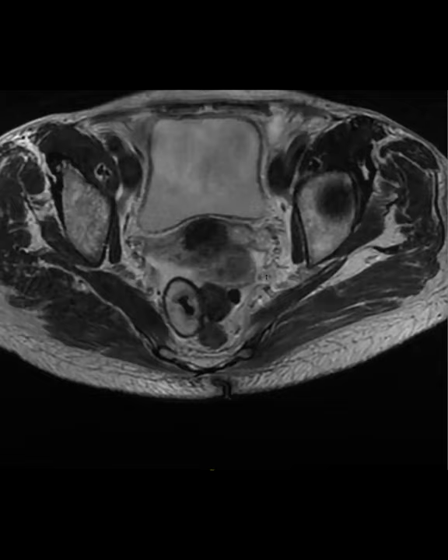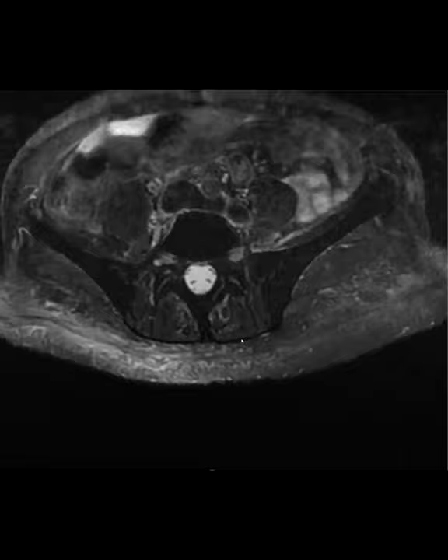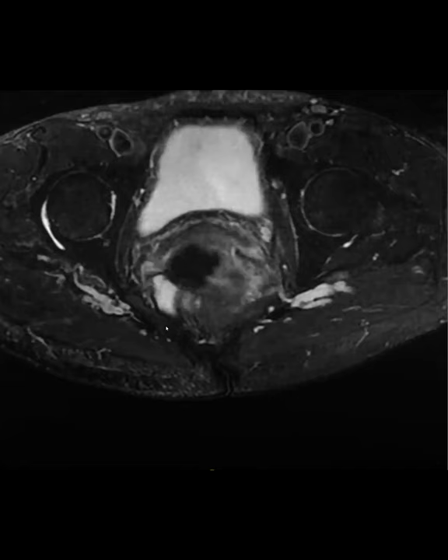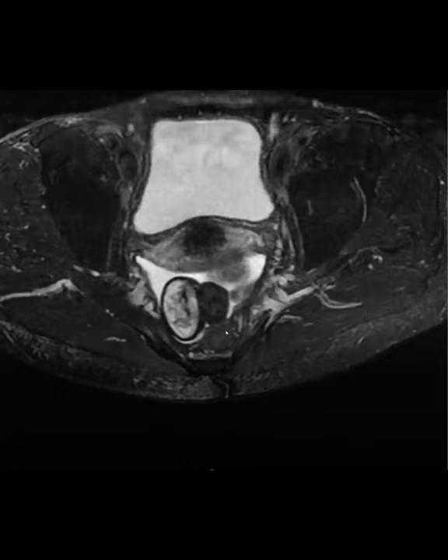So then we got this MR, and on first glance, I was thinking, gosh, could this be a teratoma? But then I thought, okay, let's look at the T2 fat sat. On the T2 fat sat, it doesn't suppress, so I guess it's more fluid signal. And so then I was thinking, is this a mass that's associated with the rectum? Like, should I be giving the retrorectal cystic lesion differential? But then I think this lesion is actually separate from the rectum altogether.